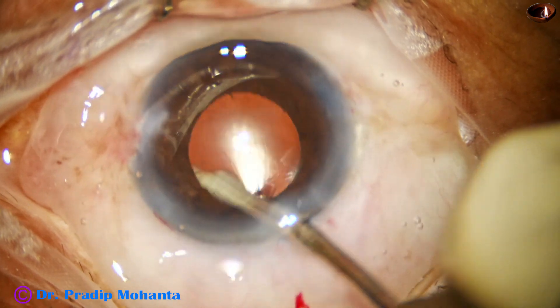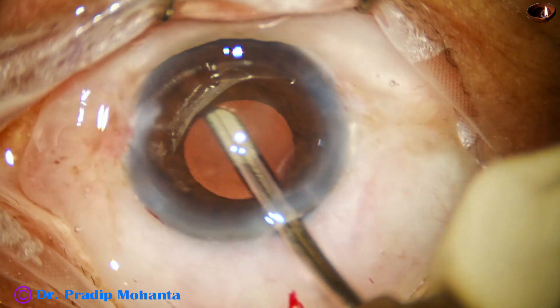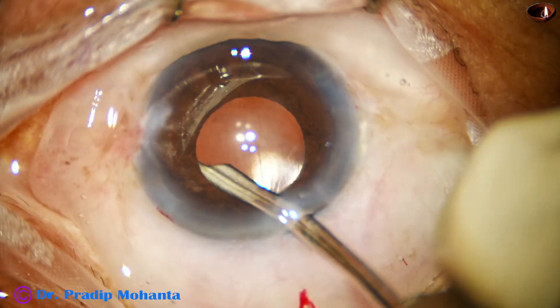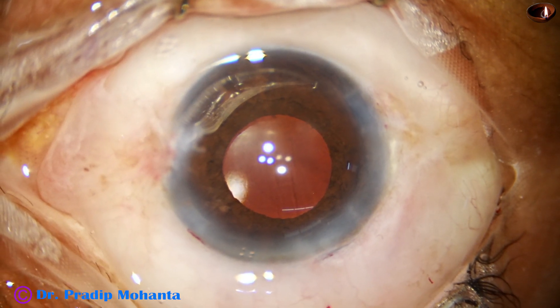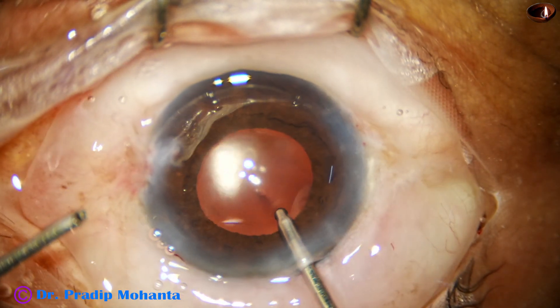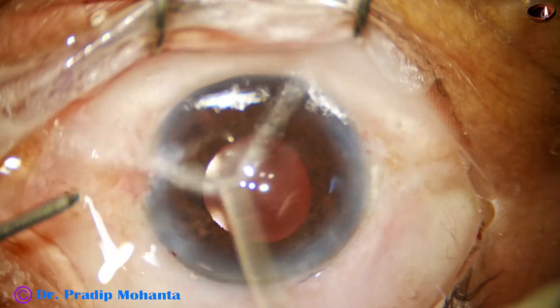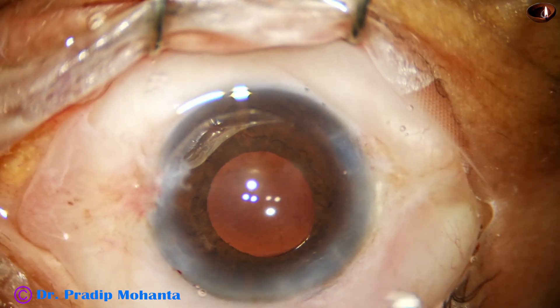We are towards the end of the surgery. This is the lavage — removing the cortex and visco both. Some little cortex was here and there, and some little fibers were here and there, and that has been removed. I use the bimanual irrigation and aspiration together. And this is a bit of moxifloxacin.